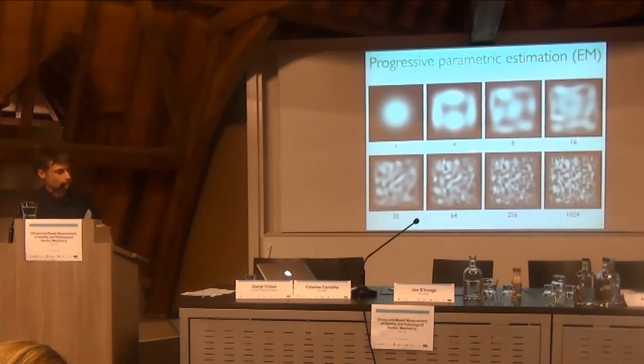So for the reconstruction, you start fetching data from your dataset, and you estimate the parameters of one Gaussian, then you split it, you get more Gaussians, and you continue fitting them to the data while improving the image definition over time.